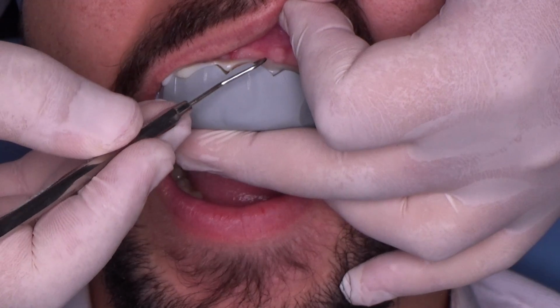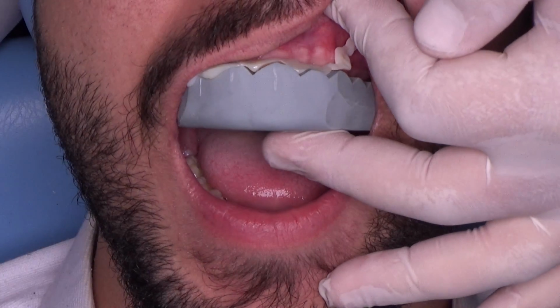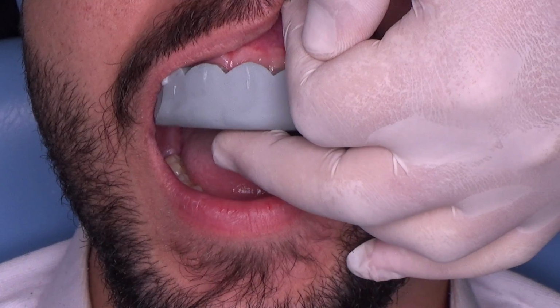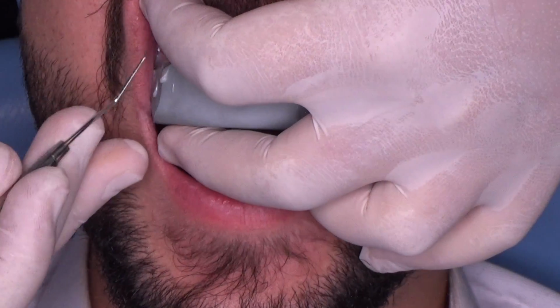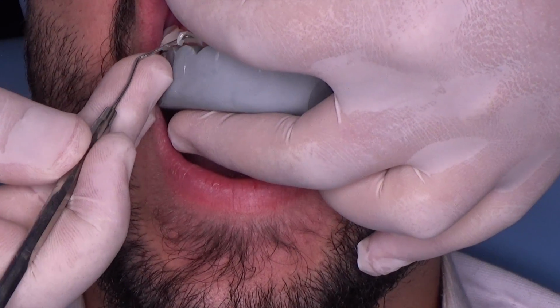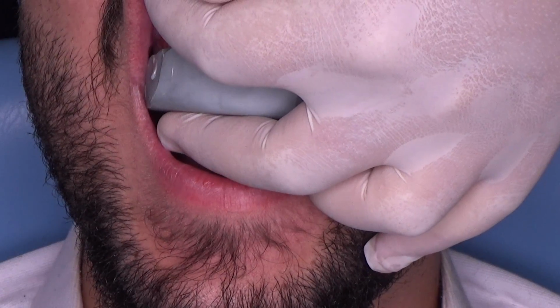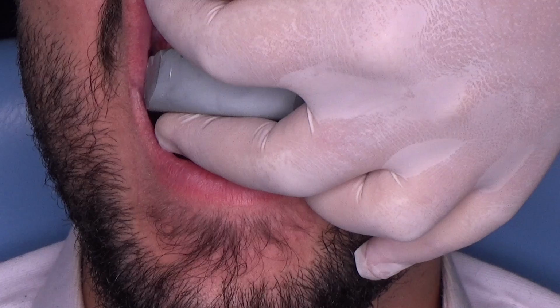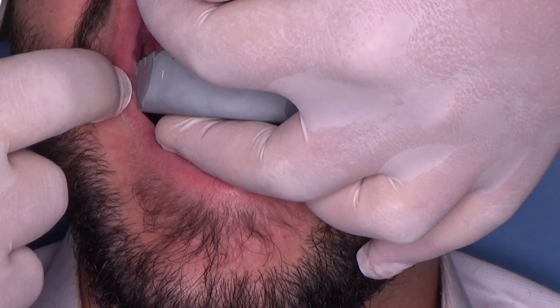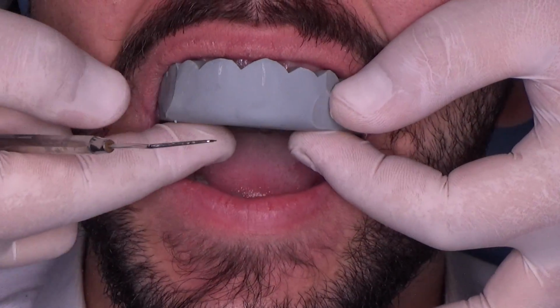See, it's time to start. It falls off very easily. So normally you will not have excess of the material. No, when we remove the mock-up, we should not do any corrections with machines in the patient's mouth. And you will wait for 2 minutes, which is the setting time of the bisacryl, no? A minute and a half to remove the excess and 4 minutes to the final. To be well set. Yes, otherwise you can remove the mock-up with your silicone together.